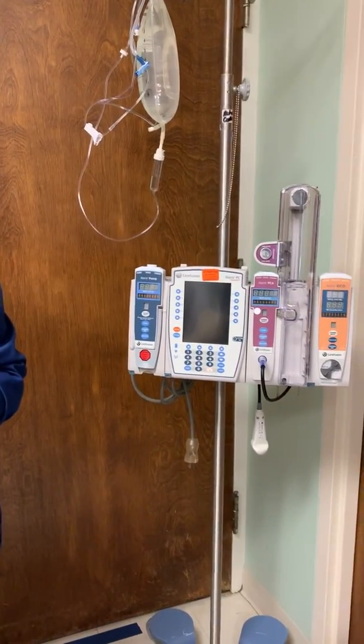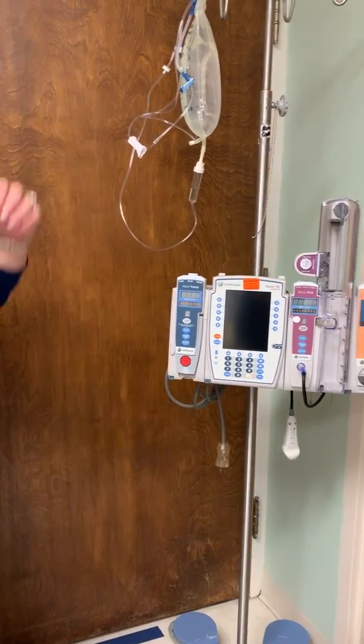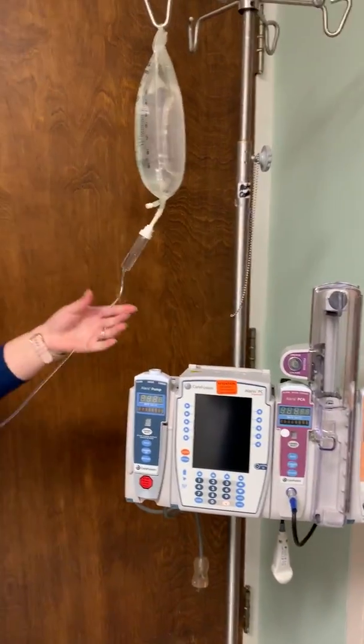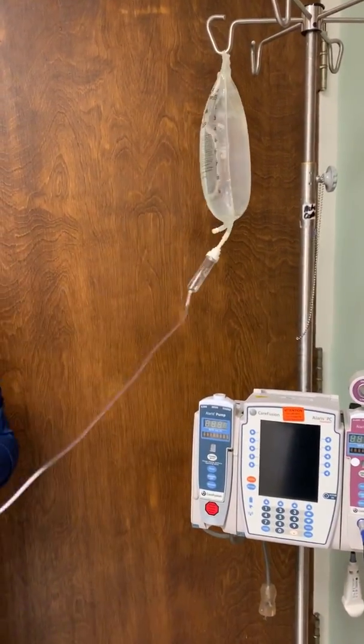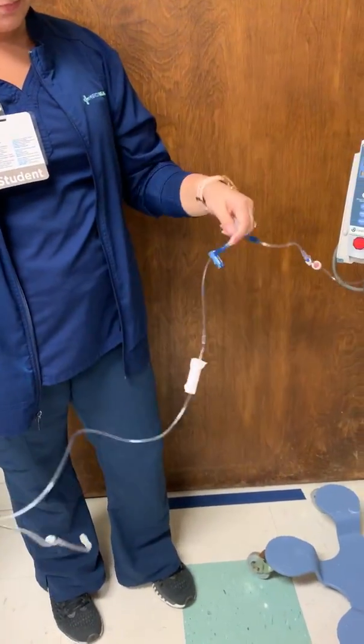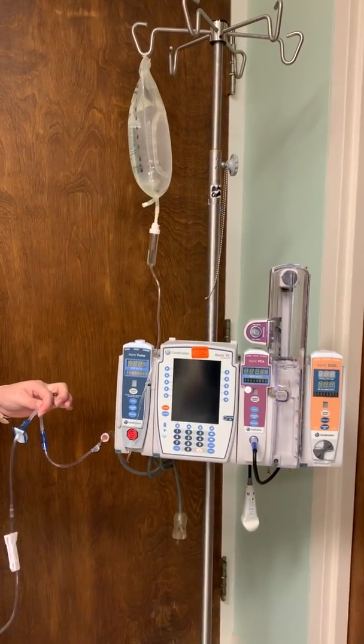Okay. So if the patient does not have primary IV fluid running, set up and manually prime the tubing for a primary KVO IV line using normal saline or other fluid designated by the provider. Don't set the pump up at this point. Just wait to set the pump up.